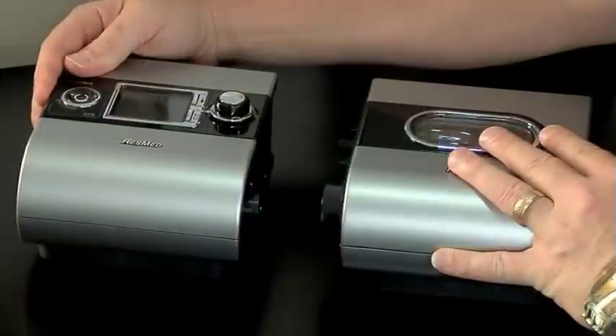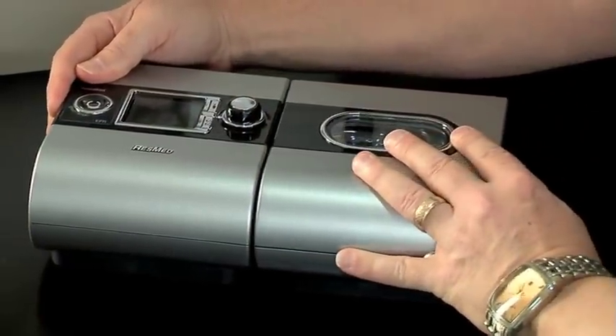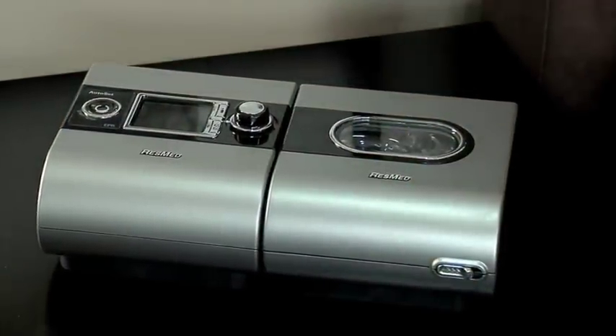Setting your humidifier is easy. Simply line up the unit with your CPAP device, then push them together until they click into place. You'll next adjust the humidity level. You can adjust the level anywhere from off to 6, and you can change it until you find the setting most comfortable for you. It's recommended that you start at 3 for regular humidification and go from there.